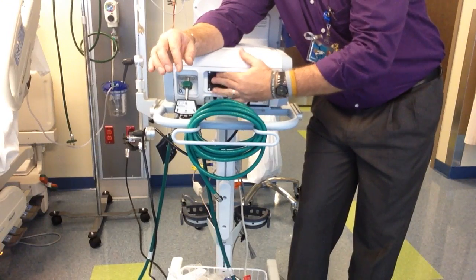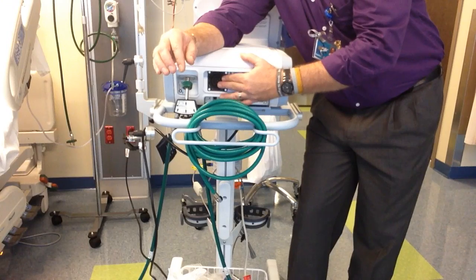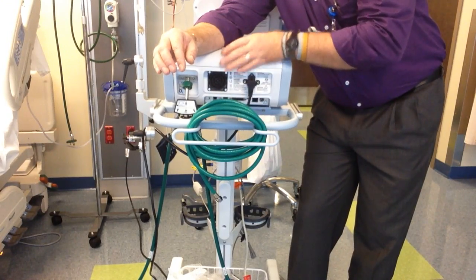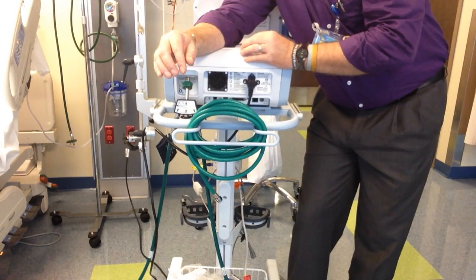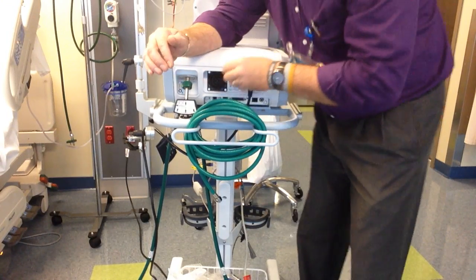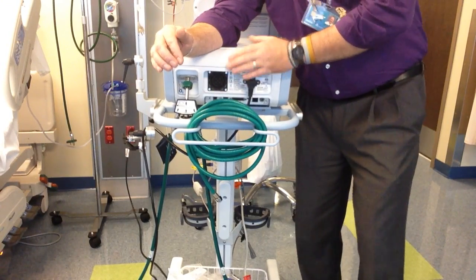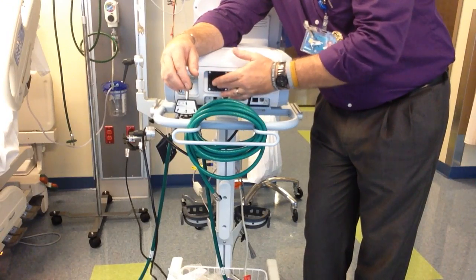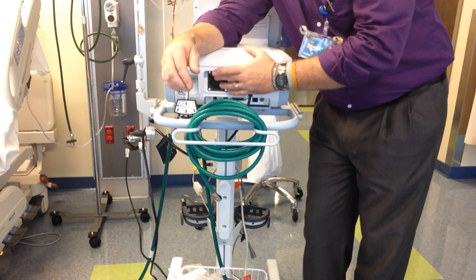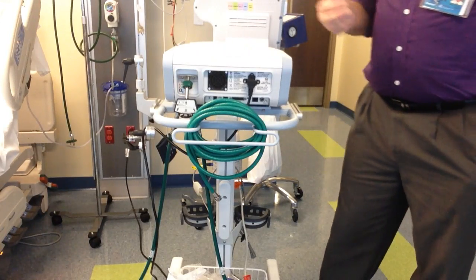This fan right here is a computer cooling fan. This computer cooling fan cools all the componentry in here. If it is white, that means it is probably covered with all the dust and it needs to be cleaned. You just take a pair of keys or something. When this is turned off, you don't want to damage the fan. Pop the grate out and you clean, there's a little membrane in there, and you want to clean it, and then you pop it all back together.